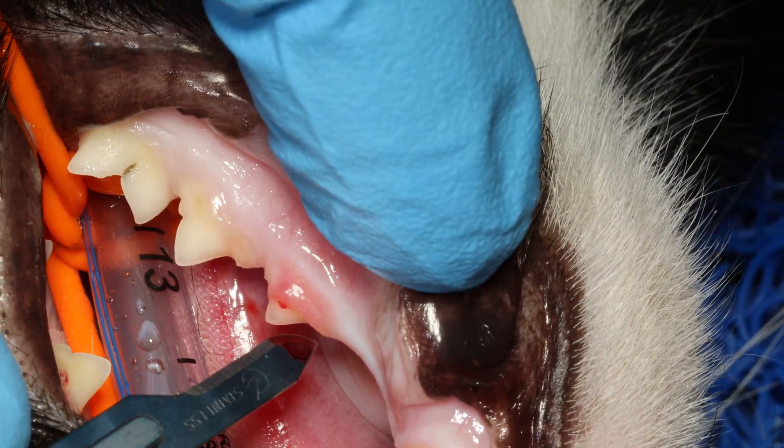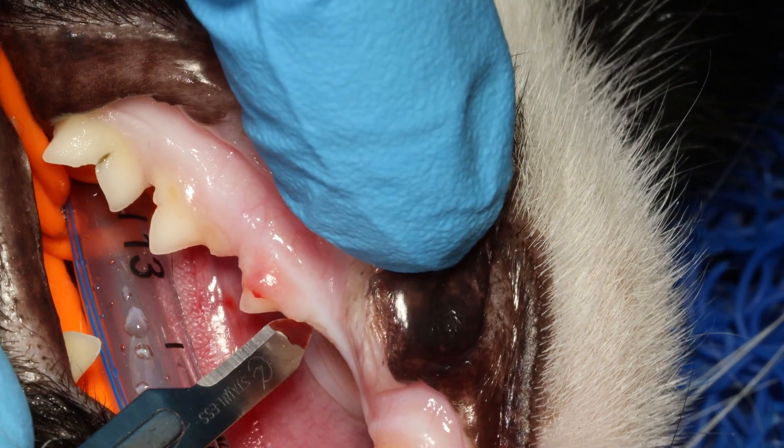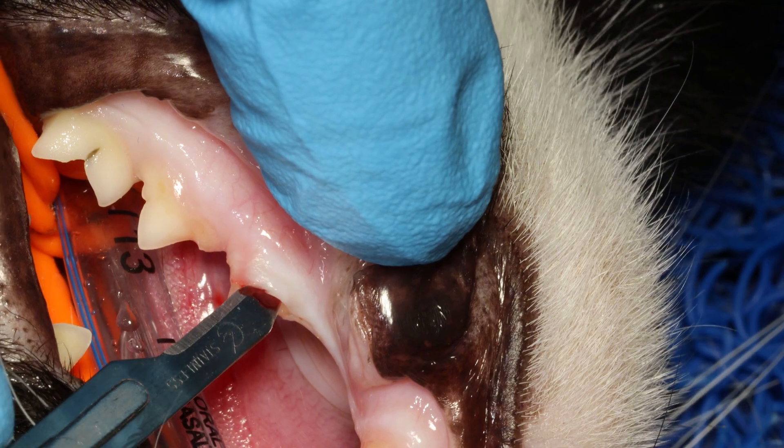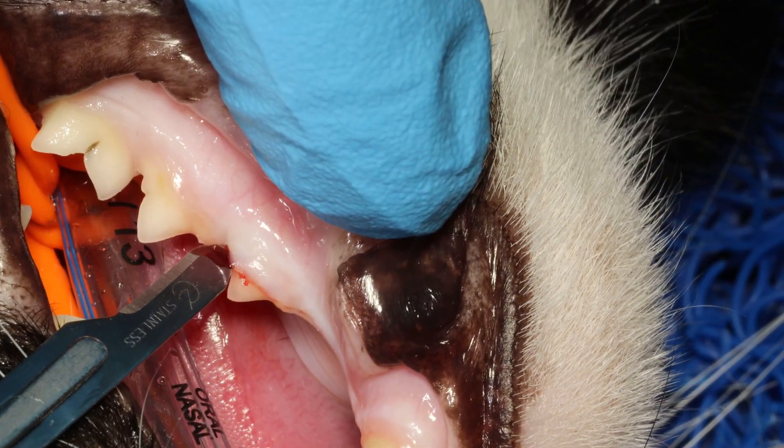That defect on the crown is painful. We don't have to do a full extraction on this one. We can do a partial extraction or crown amputation of the areas that are still inflamed.